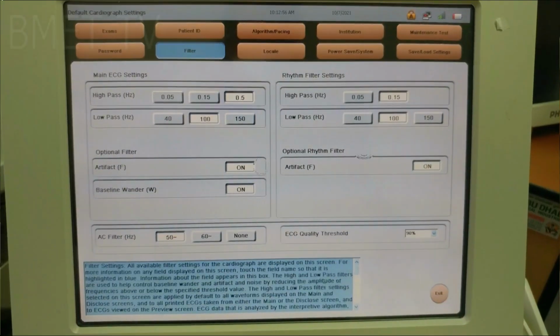High-pass filters are obviously the opposite of a low-pass filter. In hardware, a single-pole filter can be made out of a capacitor in series with a resistor. The corner frequency is the same, and the frequency response is a mirror image, a vertical flip, of the low-pass filter.